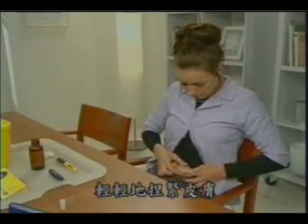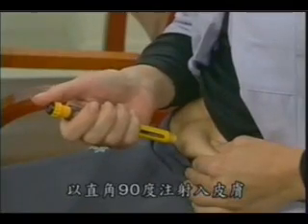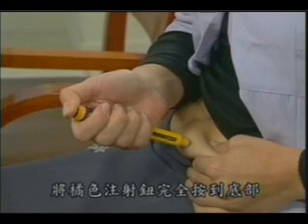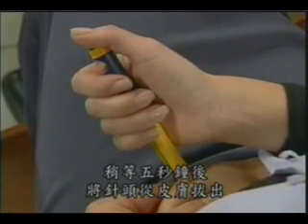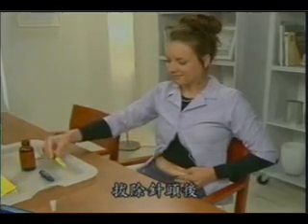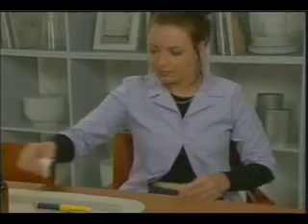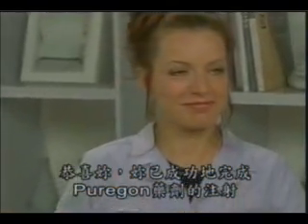Pinch the skin a little. With the other hand, insert the needle at an angle of approximately 90 degrees into the skin's surface. Fully press the end of the orange injection button. Wait 5 seconds before removing the needle from the skin. Pull out the needle. Gently cover the injection site with a piece of gauze, moistened with disinfectant. Congratulations! You have now successfully administered your Puregon dose.